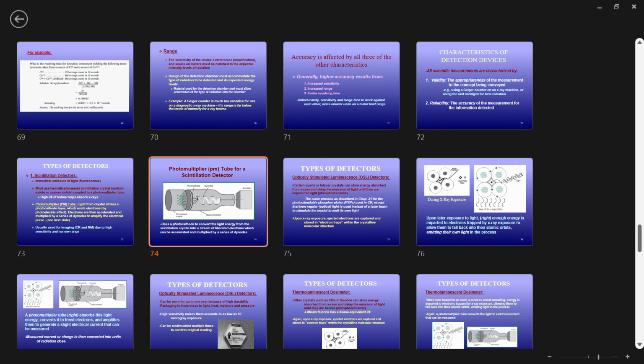And on the other side of the wall is our back office. Our workers' comp coordinator sits directly on the other side of that wall, right? So we want to make sure that she's not getting exposed unnecessarily. The people at our drug screen area are not getting exposed unnecessarily. So he's going to make measurements like that to make sure our structural shielding is up to code where it needs to be. So he's doing those exposures.